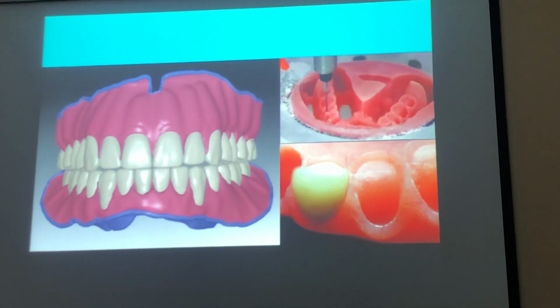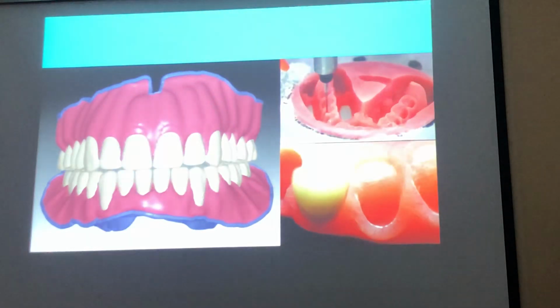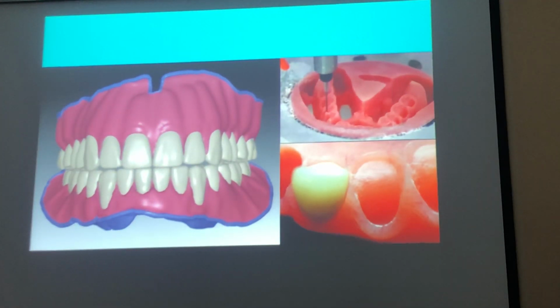After that, the lab technician will use this information together with the master cast to design your complete dentures and to fabricate them. You know what this fabrication procedure is? Milling or printing? What's the difference between milling and printing?